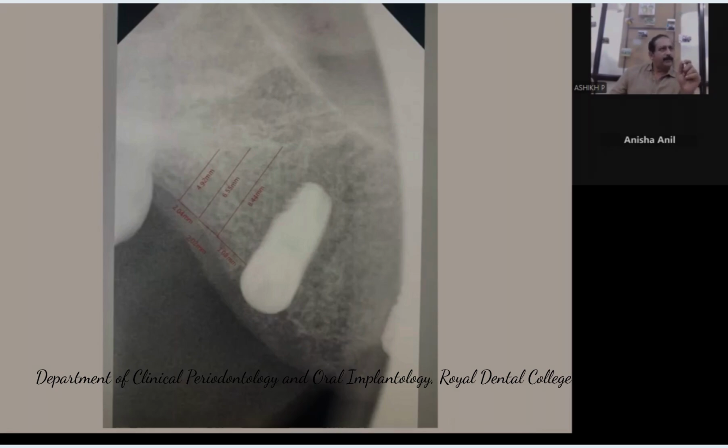So 3.75 is a good implant size, which I've already done in the other region. So 3.75 into what is the question now? So diameter, length span wise, 4 is permitted. Width you need to check and find out how much it's going to be. So beyond 3.3 we need here, because minimal length is what is expected. So anything beyond 3.3 for your company size becomes 3.75. There may be a company that gives you 3.5. There may be something that gives you 3.6 and 3.65 also. But what you have is 3.75.